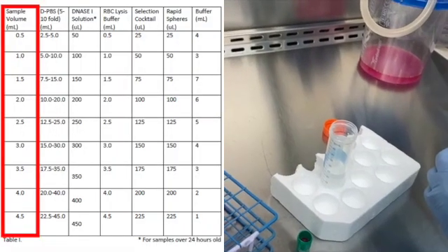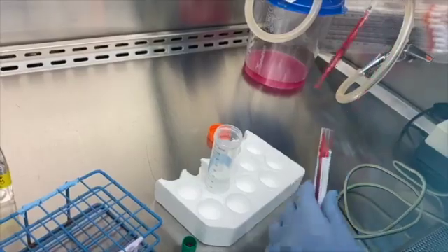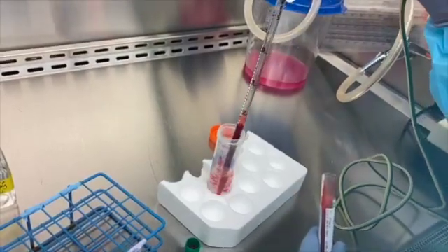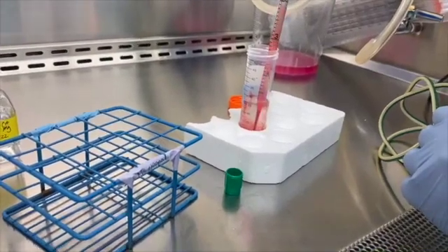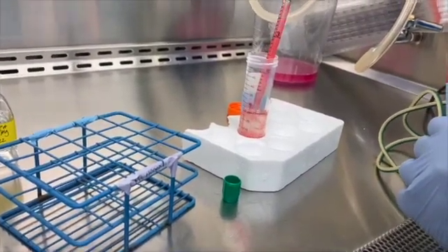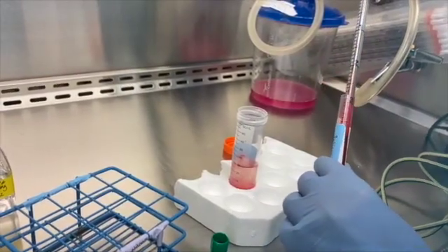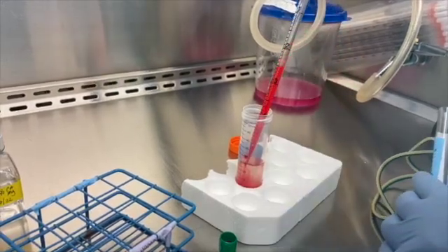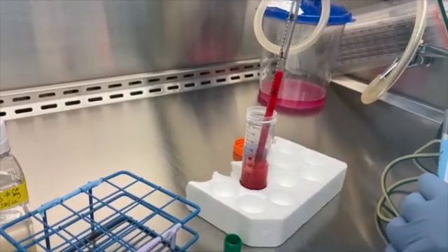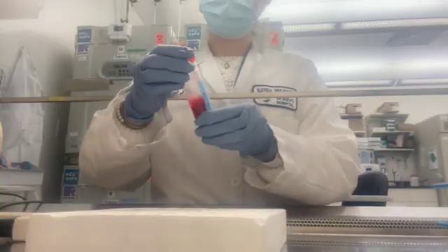The max volume of sample we can use is 4.5 ml. Try to dispense the sample at the bottom of the 50 ml tube so you can use the top portion of the PBS to rinse out the original sample tube. Due to the fragile nature and sometimes limited concentration of plasma cells, you want to be extra gentle handling the samples throughout this process. Mix the sample gently by pipetting up and down or swirling within the tube.